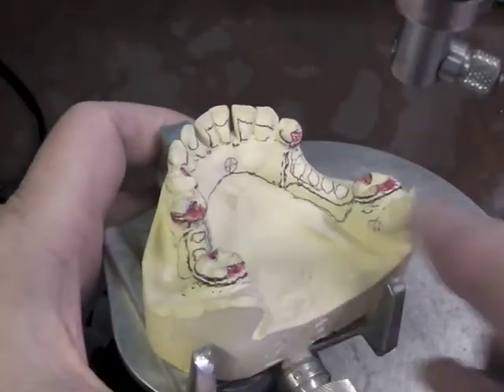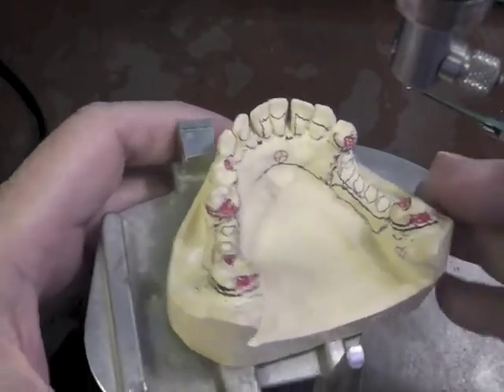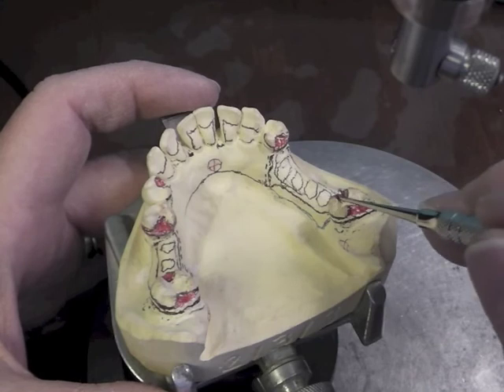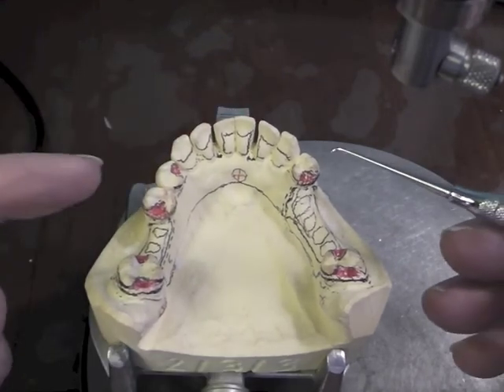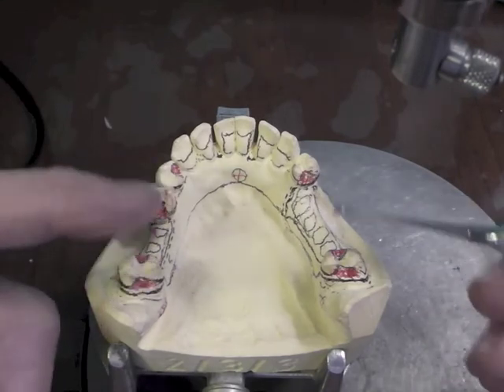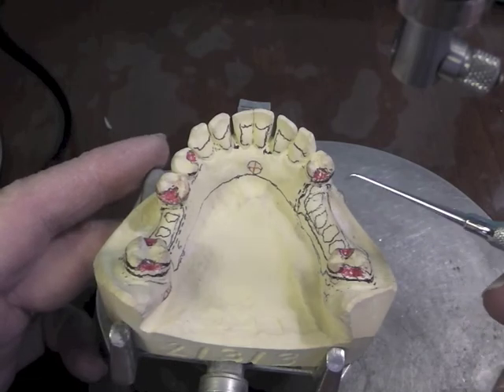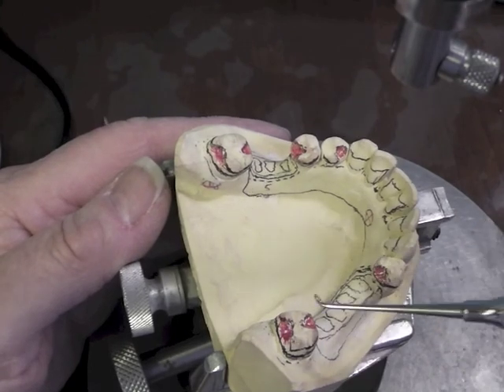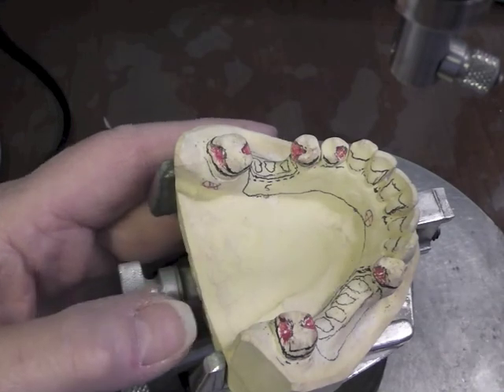I would not do this type of arrangement if I were doing a test, because it doesn't show correctly unless you note very well on the cast that you're doing this because this tooth is going to be lost. It will appear that you don't understand the rules of class three, which says we can use rigid clasping on our two abutment teeth — the four direct retainers that we will place on that. So I would stick to the other technique where you bring your major connector back, unless the faculty member tells you that that tooth is going to be lost, in which case you would make this adaptation.